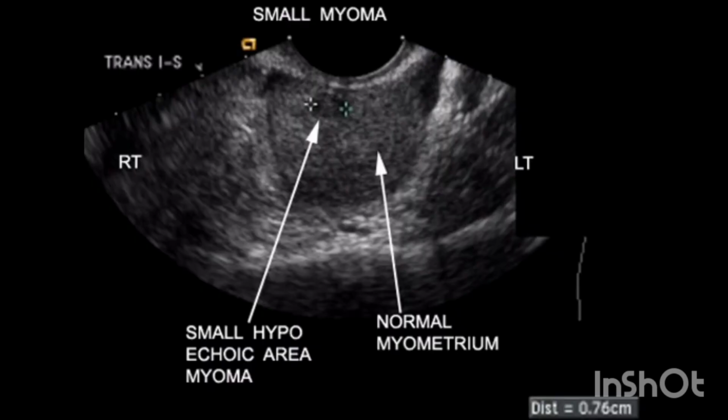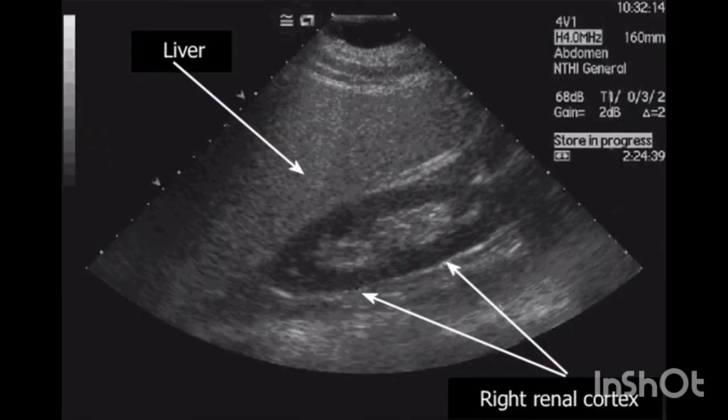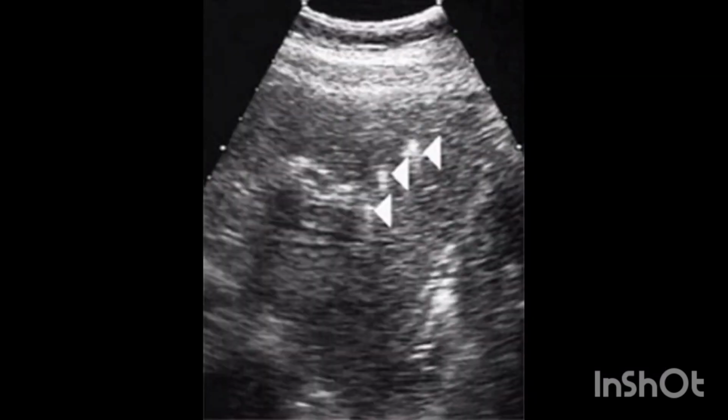Hypoechoic. This term means not many echoes. These areas appear dark gray because they don't send back a lot of sound waves. Solid masses of dense tissue are hypoechoic.